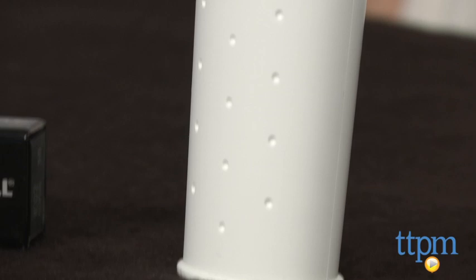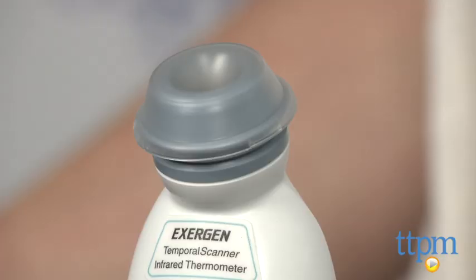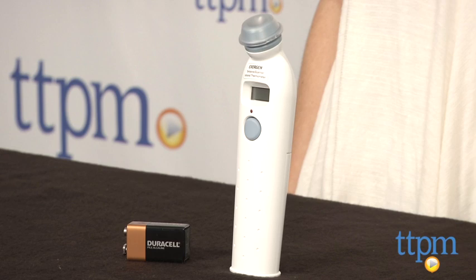Taking kids' temperatures can be difficult, especially when they're squirming infants or toddlers who won't stay still. So if this thermometer is as accurate as it is easy to use, we're sold. It seems to be accurate for us, but we've not tested it on sick children. It's safe for all ages and since it's so non-invasive, it can even be used on your child when they're sleeping.